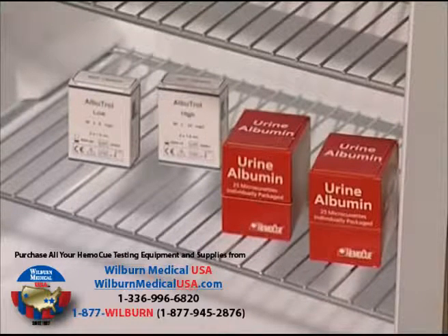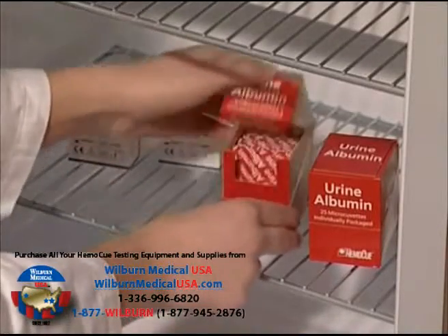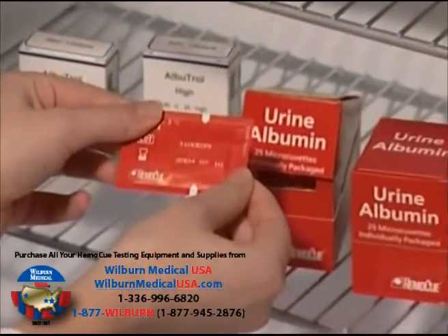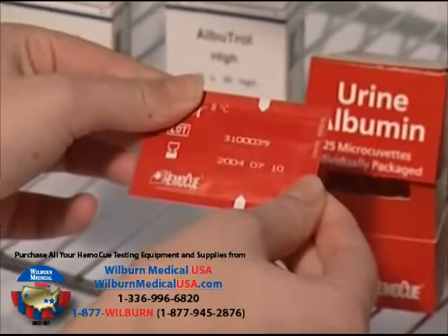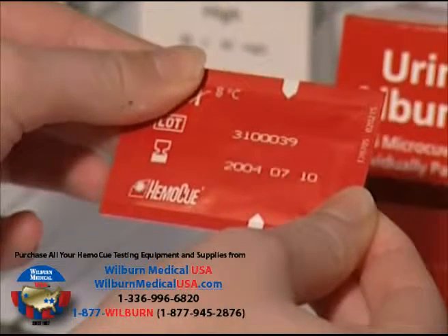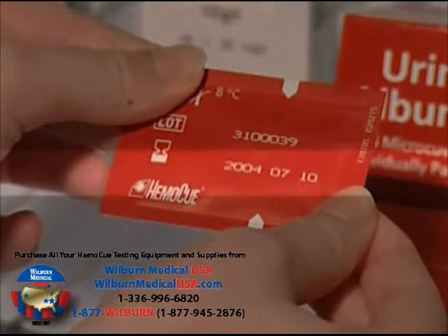The microcuvettes are packaged individually and are to be stored in their package in a refrigerator. The cuvettes must not be stored in a freezer. Each individually packaged microcuvette is stable until the expiration date, which is printed on the container as well as on each individual package. Use the microcuvettes prior to their expiration date.